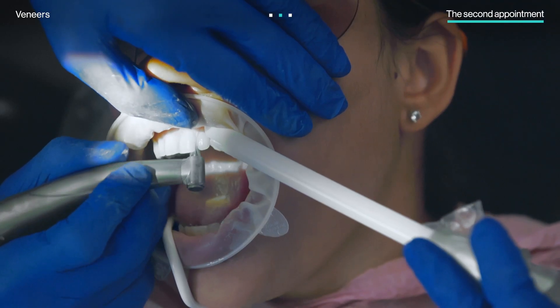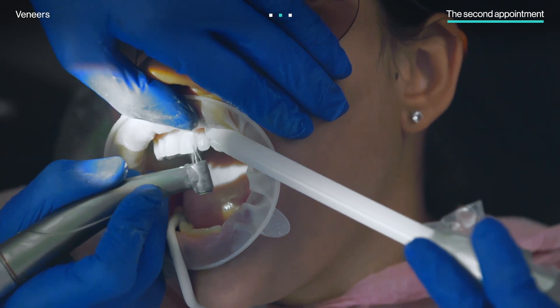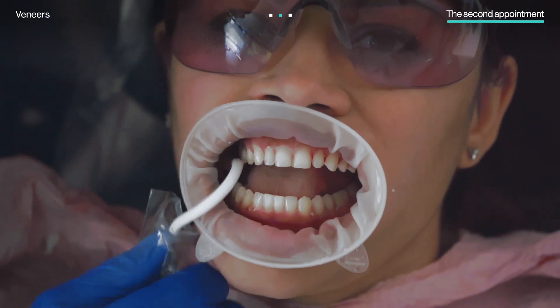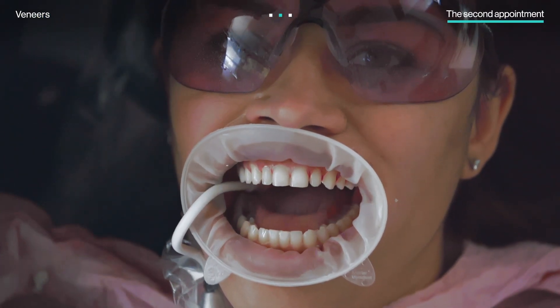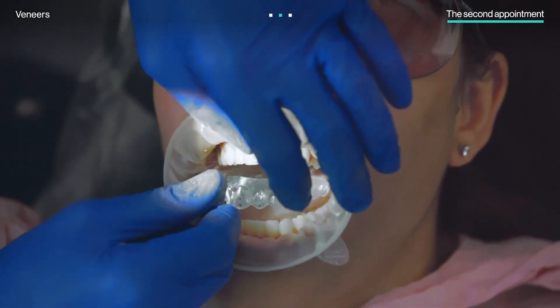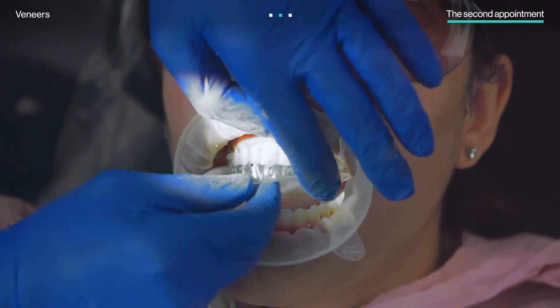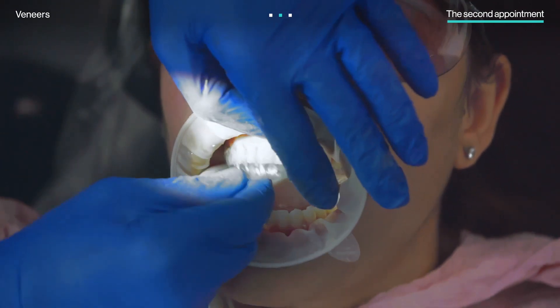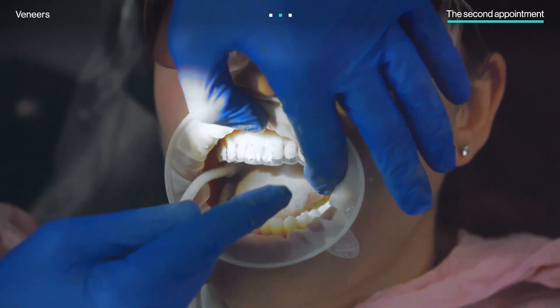Now, to craft the patient's new smile, Dr. Glassman used the preparation guide to achieve a minimally invasive surface reduction, staying within enamel level and preferably with supragingival margin.